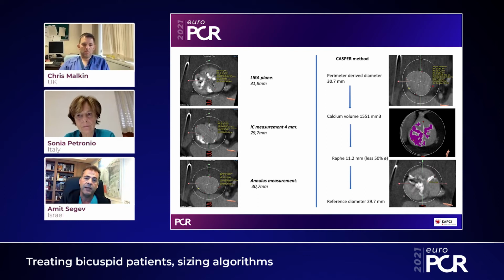So this is a very good example of a case of a tapered anatomy. I have to say that in some cases you have the opposite. You have a flared anatomy, which is totally different. This is why it is so crucial to assess the longitudinal anatomy of the case. In a flared anatomy, you actually have to oversize the valve, and if this was the case in here, it's probably beyond our TAVI options.